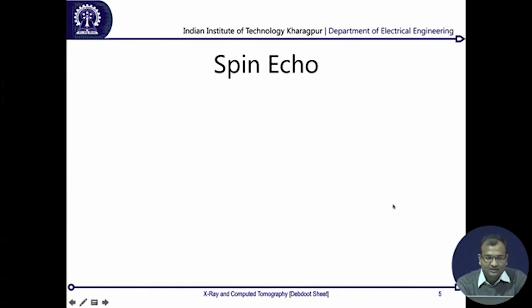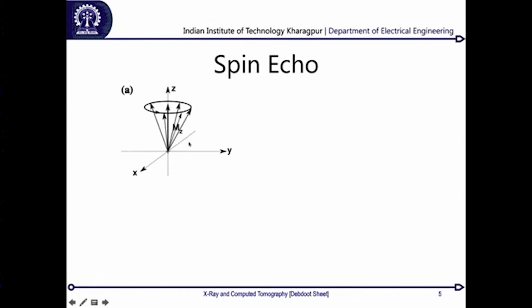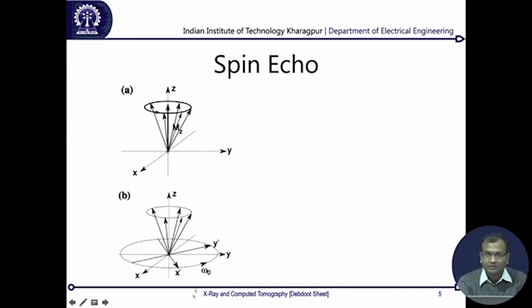Now from there, let us look at what happens if we put in energy and then observe it over a period of time. Say we put in so much energy that all the protons go to a higher energy configuration. So they are all aligned, say, opposite to this magnetic field. After some time, just because of thermal motion, they are going to lose some energy to other atoms, and as they keep losing energy, they eventually fall down to this particular plane, and then some of them will again go opposite to each other, so that the net magnetic field over here is going to be 0.